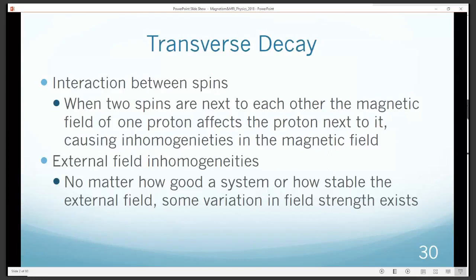And it's mainly as the signal from the piano string decaying is due to frictional elements in the string, causing its resonant properties to not be able to support this sound. The dephasing of the magnetic spins, or at least the transverse components of the magnetic spins, similarly, you can think of it as being the friction that causes the MRI signal to go away.